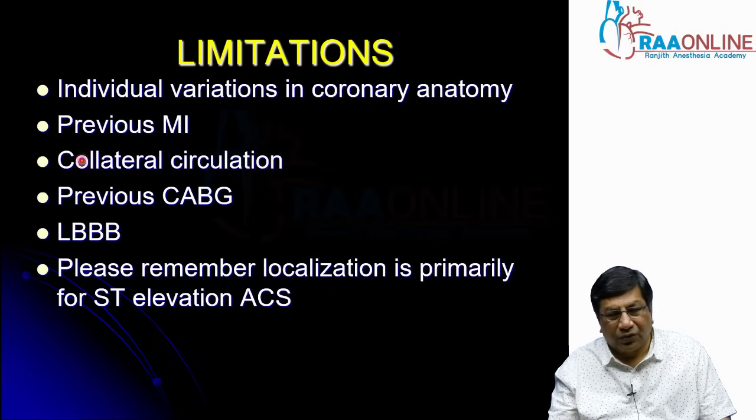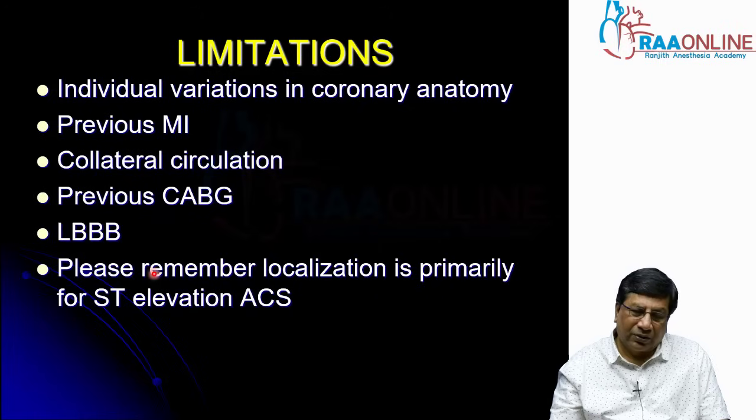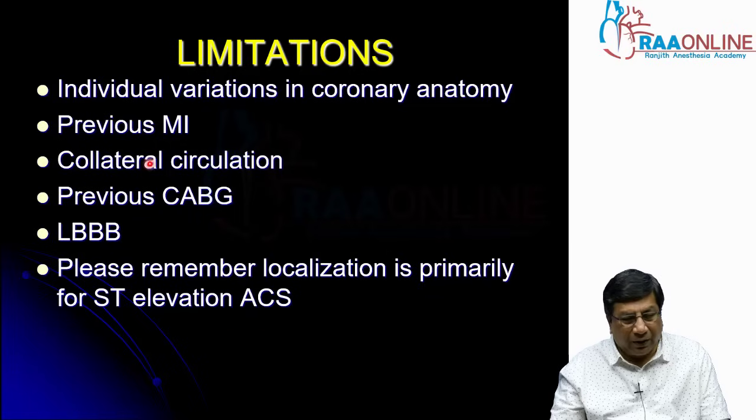So also I have told you so many things about the location of the coronary artery, and also beyond the coronary angiogram, ECG gives you very important information about viability, decision regarding revascularization. It will tell you the severity of that obstruction, whether it's a grade 1, grade 2, grade 3. All this information is not governed by coronary angiogram. It gives you so much information other than the obstruction shown by coronary angiogram.